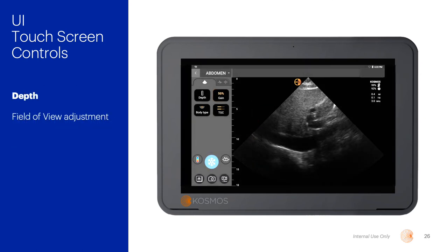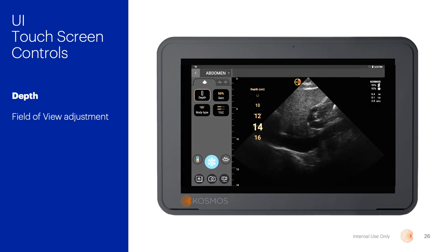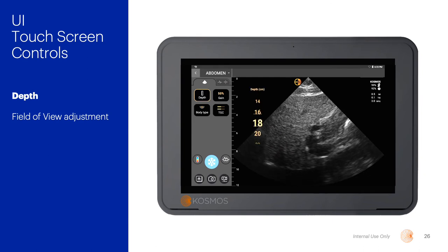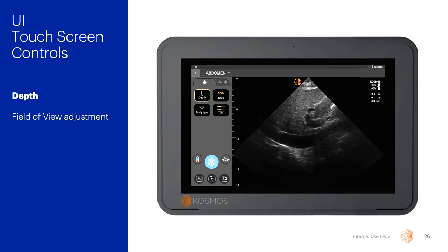Another control in the user interface is called depth. This is our field of view — how much we can see into the patient from the top of the screen to the bottom — and it is measured in centimeters. Be sure to maximize the field of view with the area of interest displayed in approximately the middle third of the viewing display, while also being careful not to omit deeper structures because we have the control set too shallow.